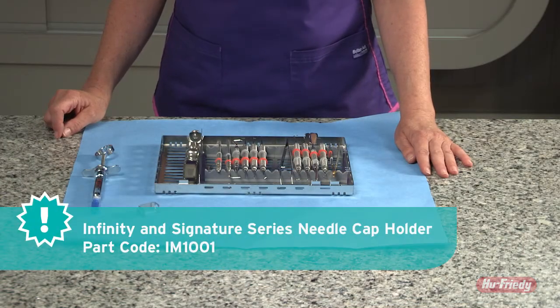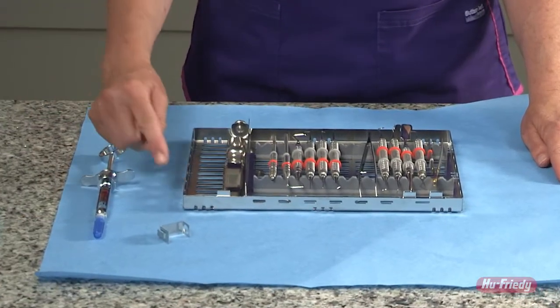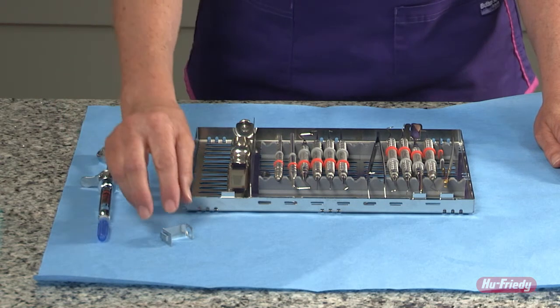To insert a standard needle cap holder into a Signature Series cassette, it can be placed on the base of the cassette in one of the corners. It is best to choose a hole that will prevent it from sliding across the cassette.